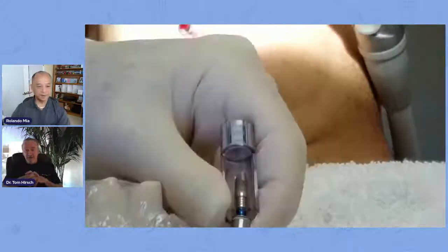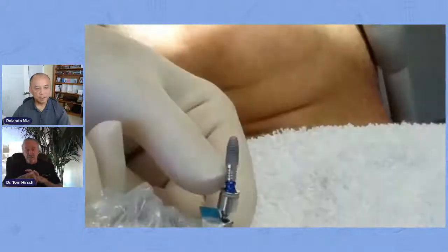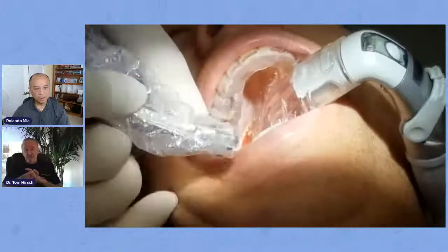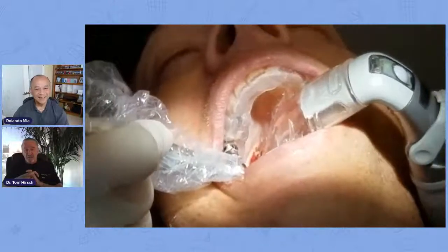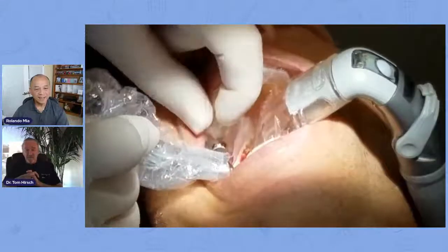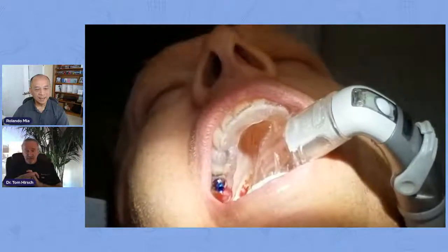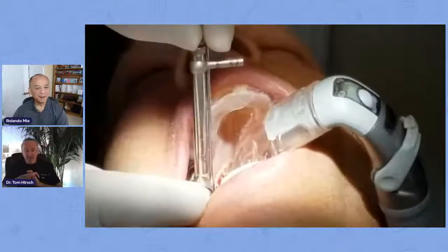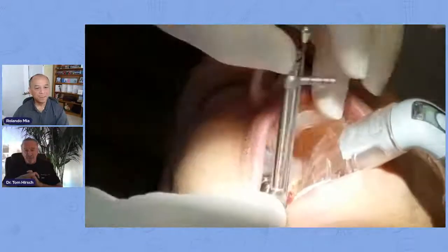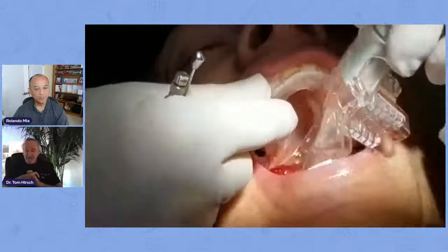We take our implant — there are lots of implant systems out there. This was Implant Direct. A couple of years ago I was using the replant type system, which is the Select Replace clone. The implant goes in very nicely. We bottomed out right now. So now that it's bottomed out, I take my torque wrench — I didn't have any more access — and I torque it into place.